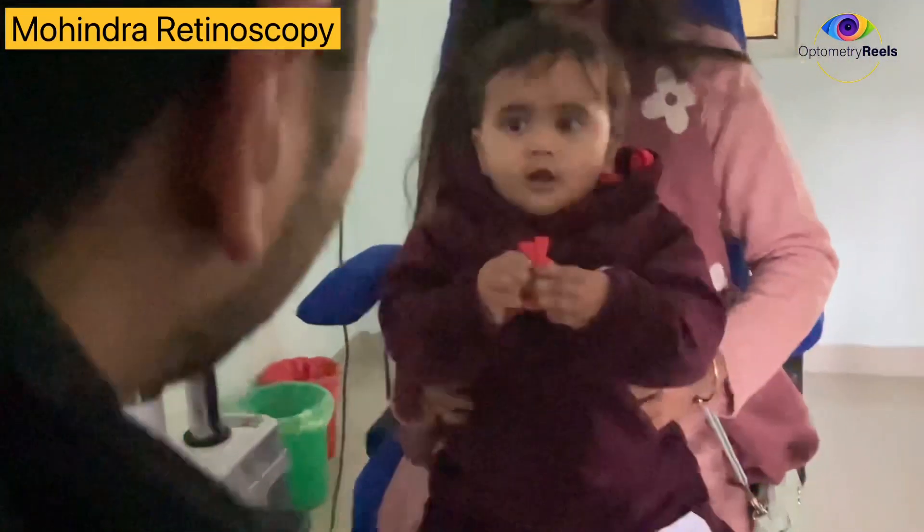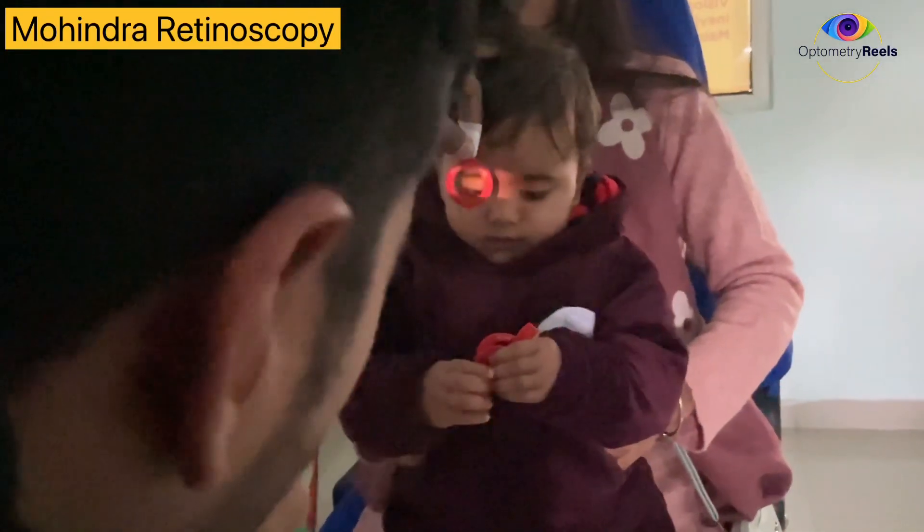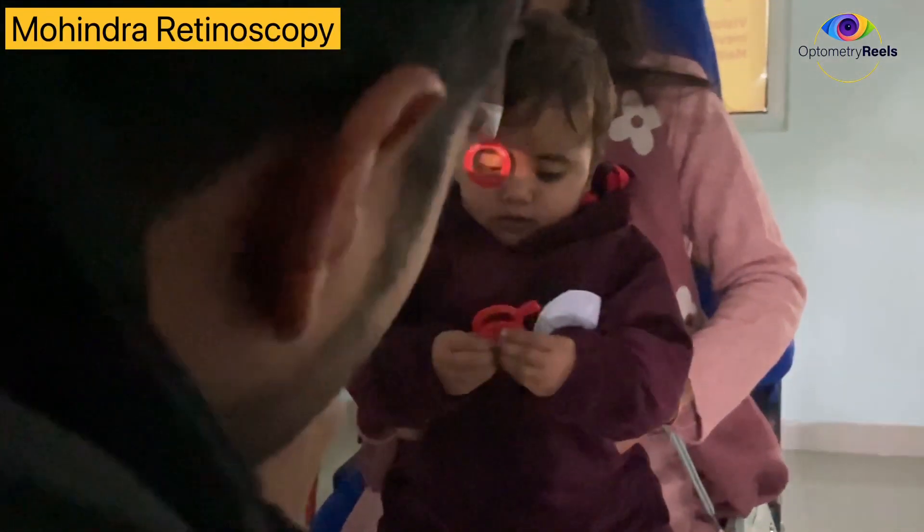He is facing the lenses. Can you see the light?